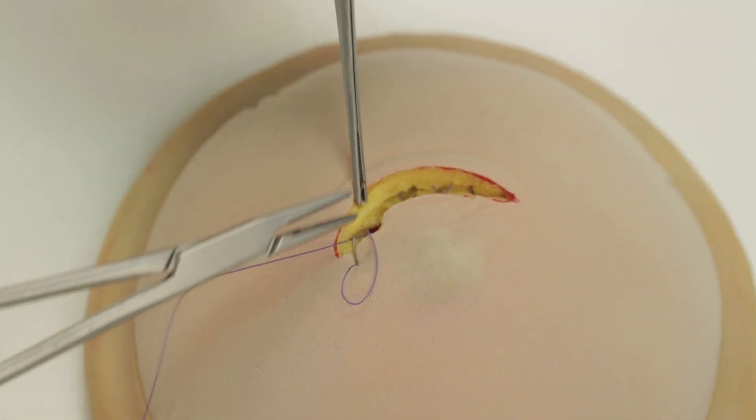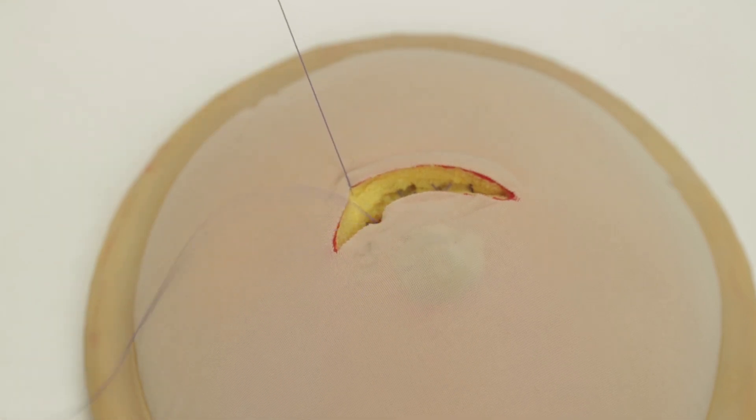The skin incision should then be closed with a subcuticular suture, although we have not demonstrated this here.